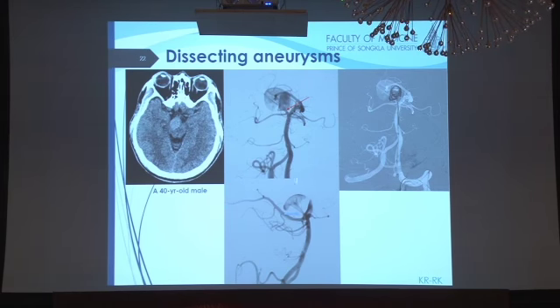It's a jet flow and intimal flap. Intimal flap is large. So the flow to the proximal portions of the stack came from the right P1 segment. So we put some coils to occlude the aneurysm from this side.